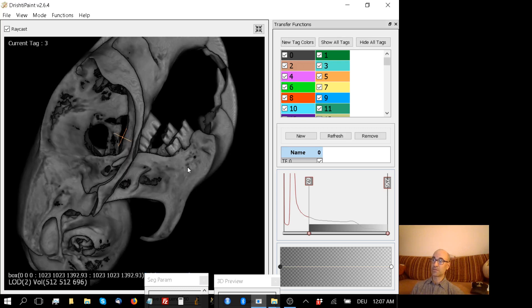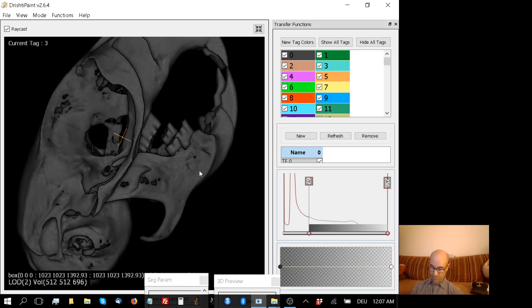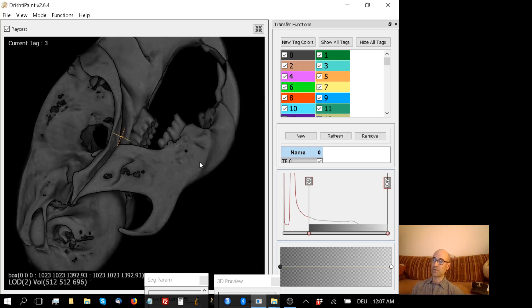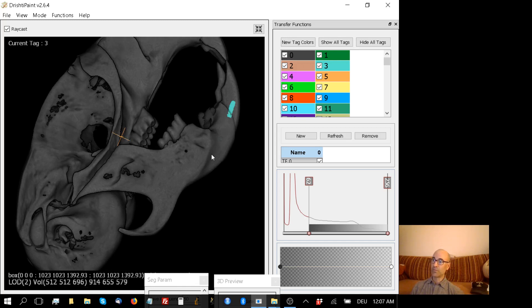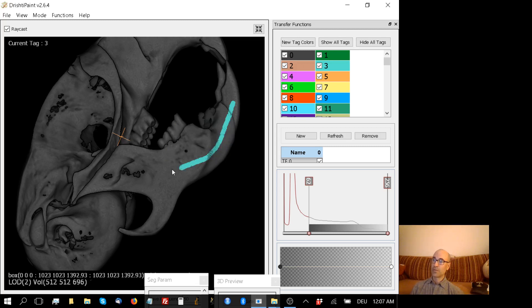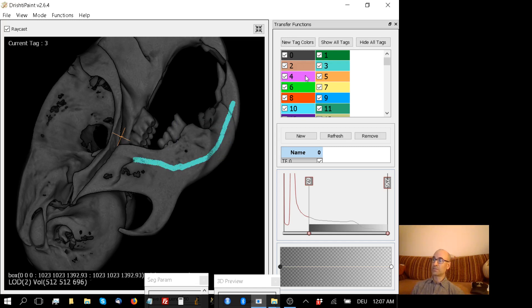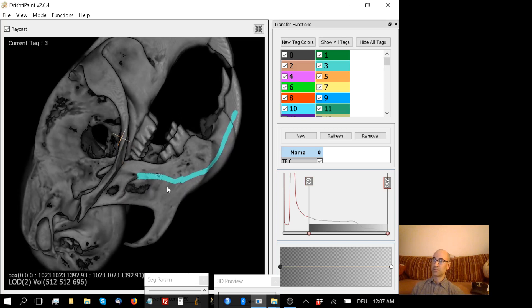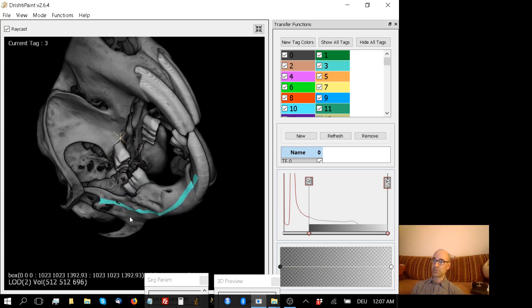It's not a trivial exercise. So in order to do that as fast as possible, I'm going to hold down the shift key and I'm going to left click and just drag the pointer across this jaw. And you see that was an auto-save that just flashed by the screen. You see this line containing my tag 3 that I've just told Drishti.